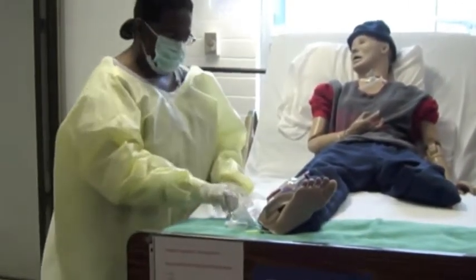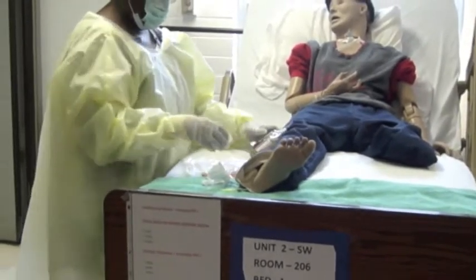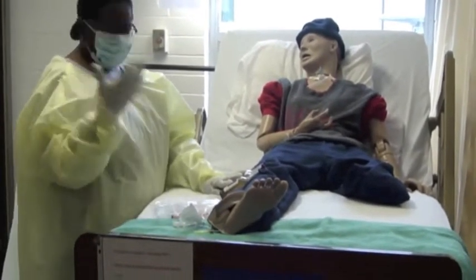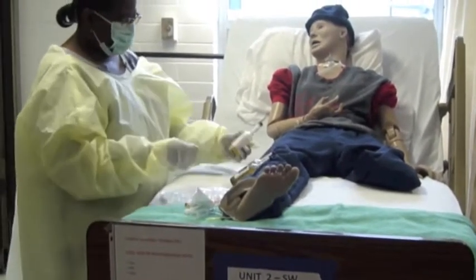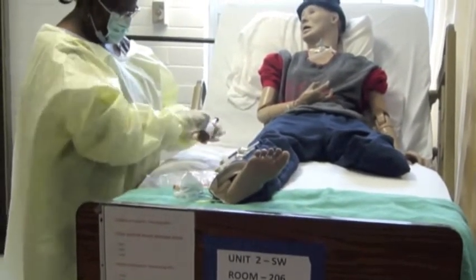Okay, so now I have to label. This is the part you don't like to do because you still got to be in a patient's room. But you still have to label time, date, sign, initial. I drew the right arm, and it's number 1, number 1, number 1. So, my label. Almost out of your way now, sir.